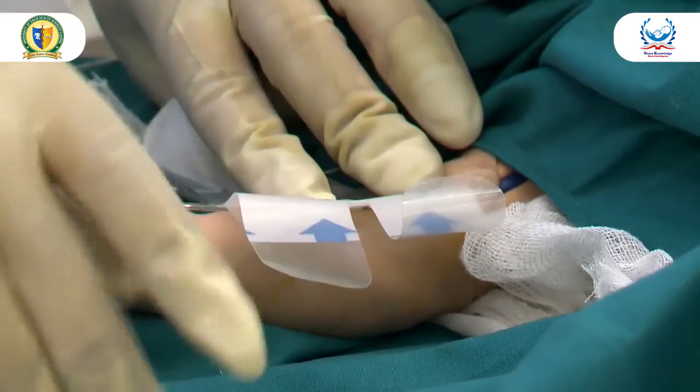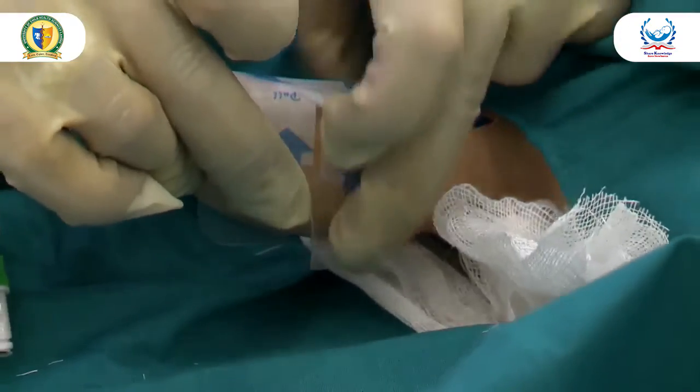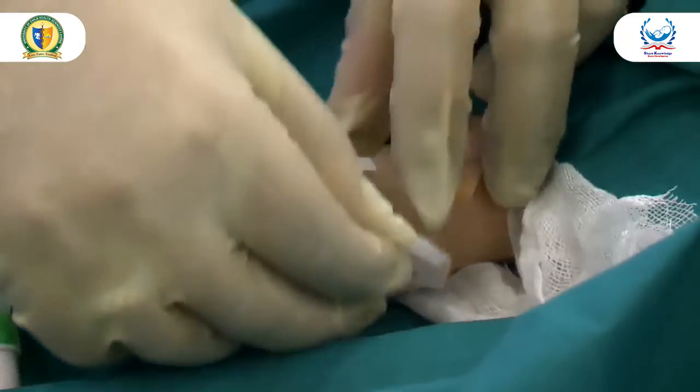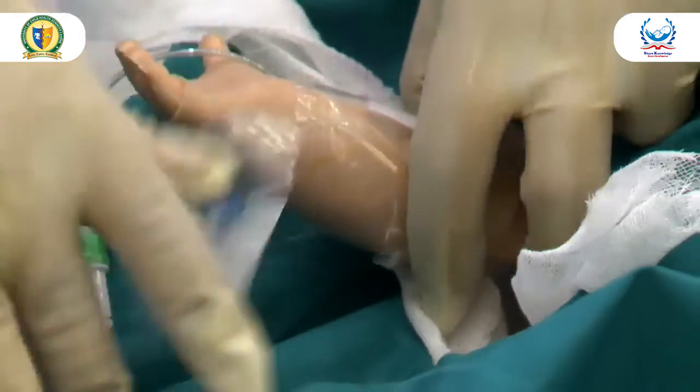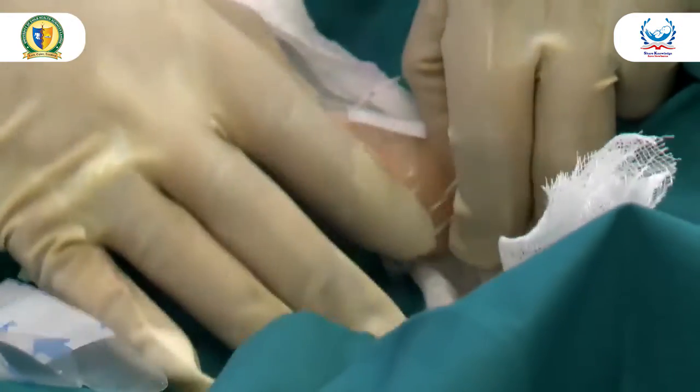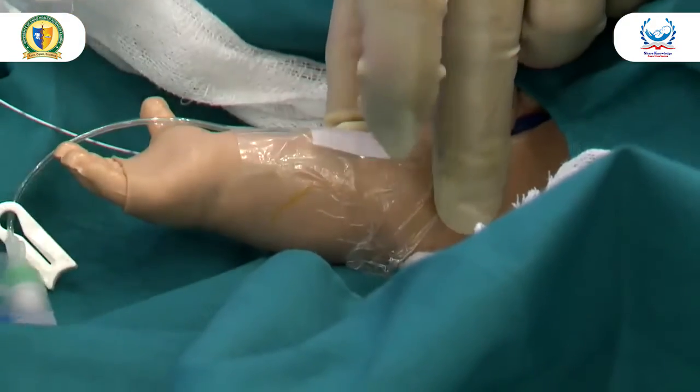The only thing is that the handlers, I tell them not to swing the baby by holding the line, and not to pick up the baby by the line. Because it can move, if the line moves up and down inside the body of the baby, it will increase the chances of infection. So it has to be secured very nicely.